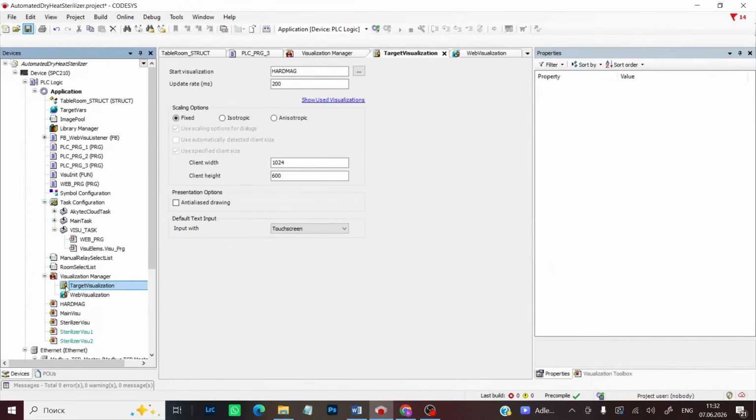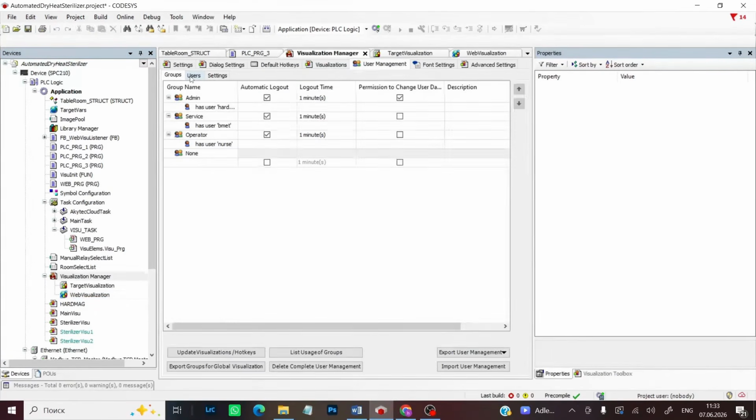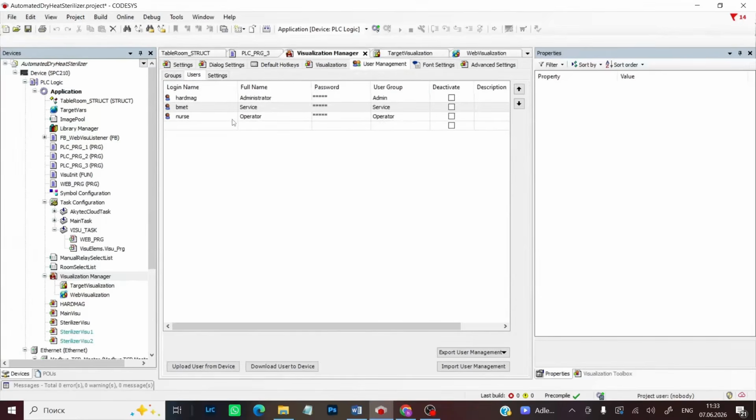As the start page, I specified the visualization file with our frame in the device tree for both the target and web visualization components. Next, in the Visualization Manager under the User Management tab, I created 3 users. The first user has administrator rights, meaning they will manage user access rights to the visualization components of the control system. The second user will have maintenance rights for the entire control system, meaning he will monitor its operability. And the third user will have sterilizer user rights, meaning they will be responsible for sterilizing medical instruments.